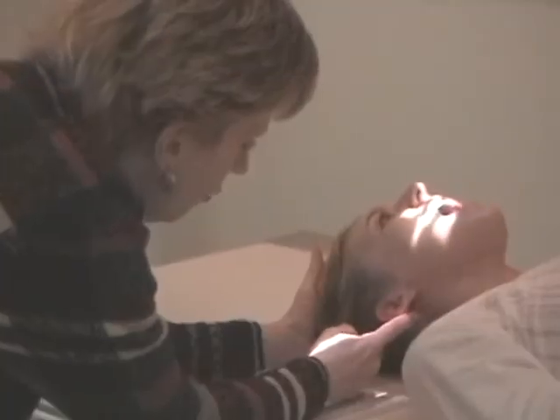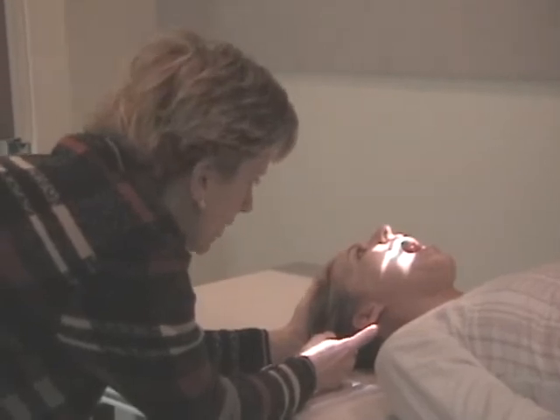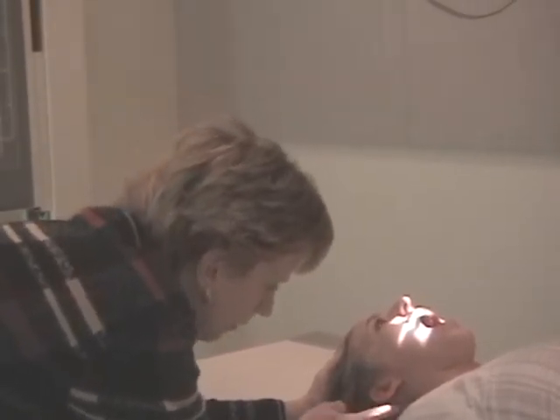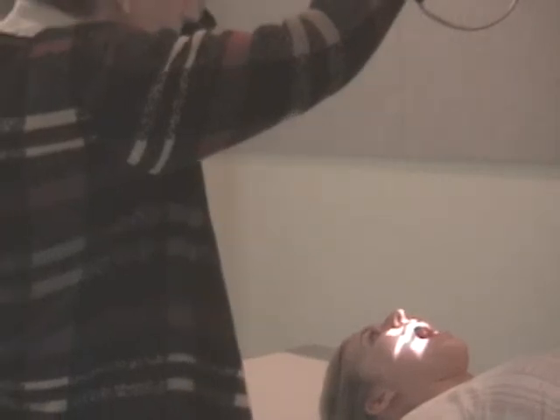Patient opens their mouth, mastoid tip, inferior border of the superior teeth. Kristen, can you tuck your chin just a little bit? Very good. Again, mastoid tip, inferior border of teeth. Once you have that lined up, patient, just move quickly, center right over the patient's mouth, the crease of the mouth.